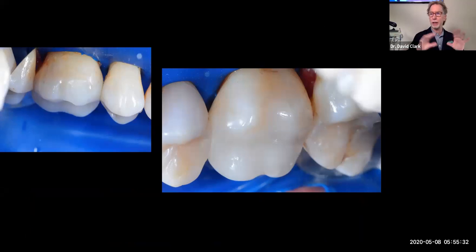So I wanted to put up basically the new progression of how we take care of a tooth that's cracked or deep decay. The decay wasn't a lot of decay here, but I wanted to show the kind of restorations that we're seeing in dental schools. The dental students, you dental students, are doing tough composites. I mean, big composites, cuspal replacements, cracked teeth, restoring teeth with endodontic treatment that have to be stabilized.